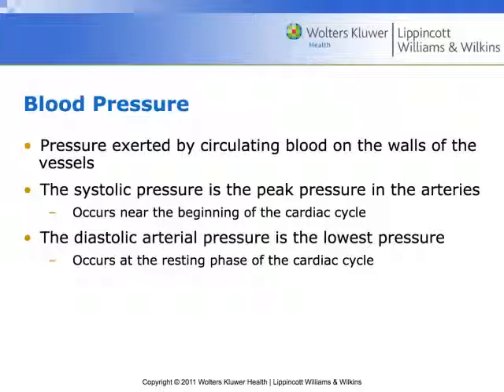Blood pressure. So systolic is the peak pressure, diastolic is the base pressure, and the way that you can measure that is with a blood pressure cuff and a sphygmomanometer. Yes, okay. You crank the thing up to at least like 120, 130 pressure on their arm, right? You slowly let it off while you're listening for it. You'll hear a whoosh sound, right? And that's going to be your systolic pressure. When that whoosh fades off, that's your diastolic, right?